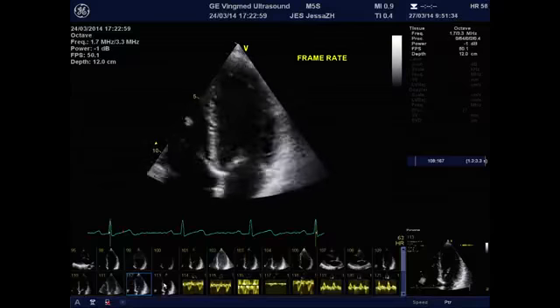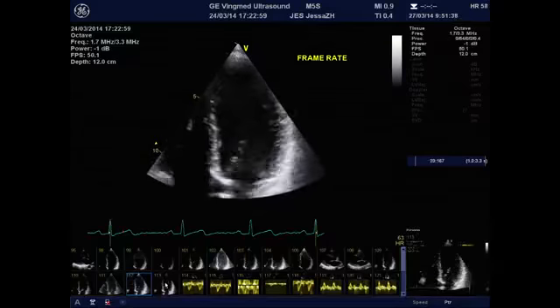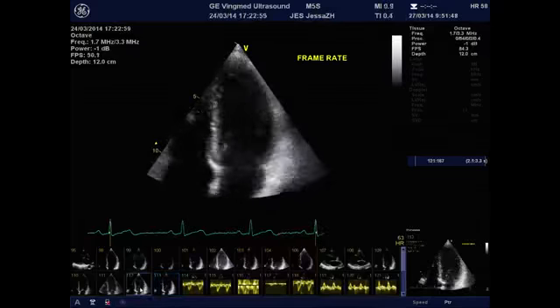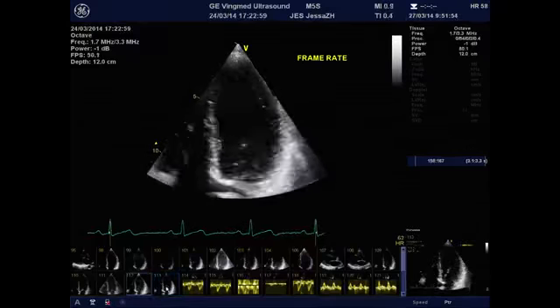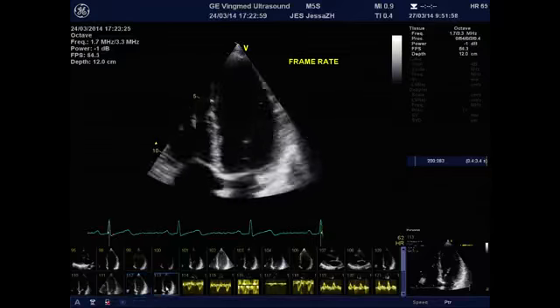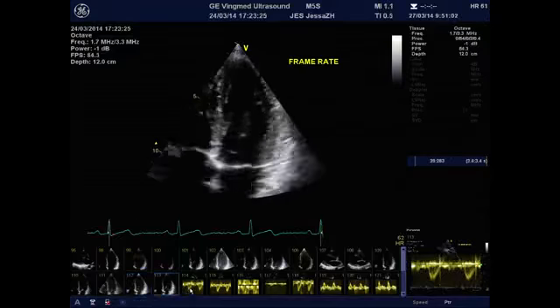And again, for certain post-processing algorithms like speckle tracking, you need a high frame rate. In this case, you see the frame rate is 84. In my other example, you can see where it's 50. For normal echo settings, you should not have your frame rate too high in 2D grayscale imaging because it will reduce your lateral resolution, which you need to get optimal imaging.